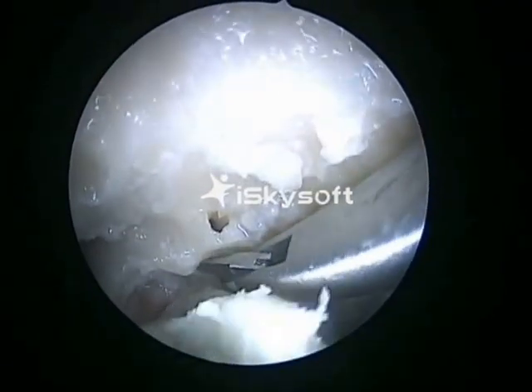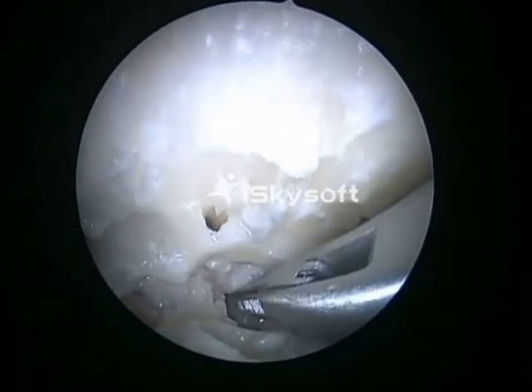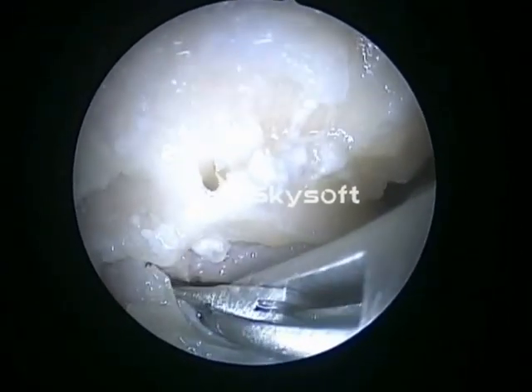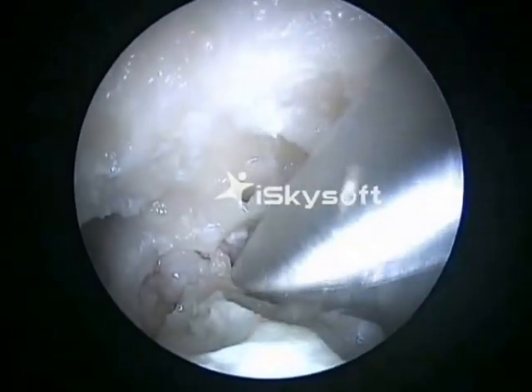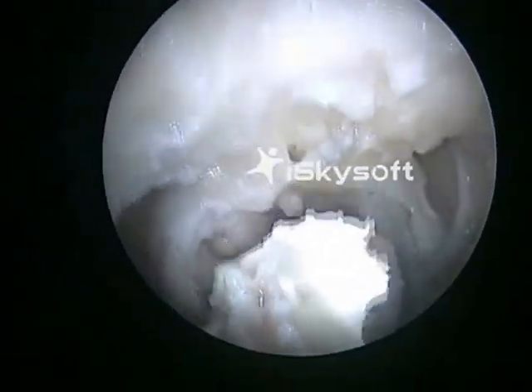You can now see the scissors being used to cut the falx cerebri. That's the falx cerebri.